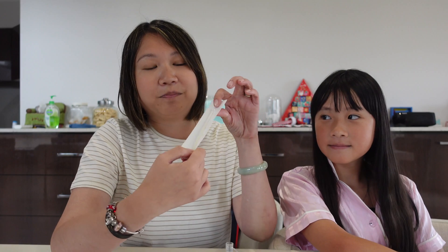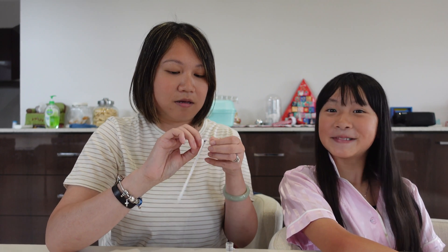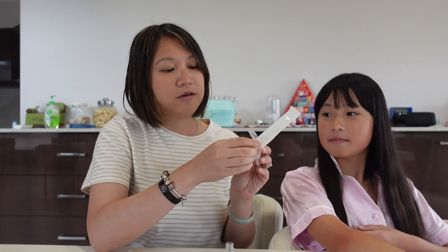Next step, you need to get the swab. Make sure you don't touch the tip of the swab — so be very, very careful. Right here.